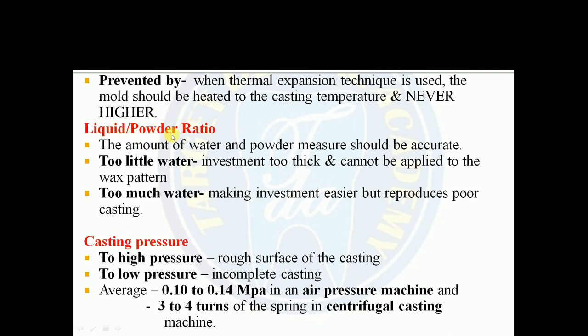Your liquid powder ratio should be accurate. If you are using too little water, the investment becomes too thick and cannot be applied to the wax pattern. If you are using too much water, it makes the investment easier but reproduces a poor casting. As for casting pressure, too high a pressure causes a rough surface. Low pressure causes incomplete casting. Average is 0.10 to 0.14 megapascal in the air pressure machine and 3 to 4 turns of the spring in the centrifugal casting machine.